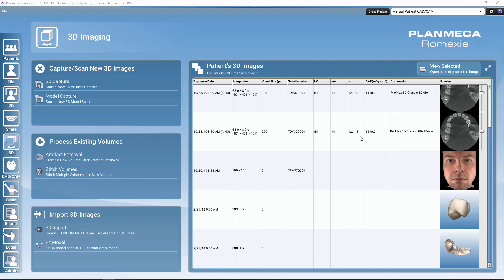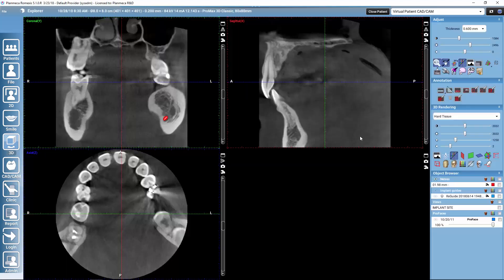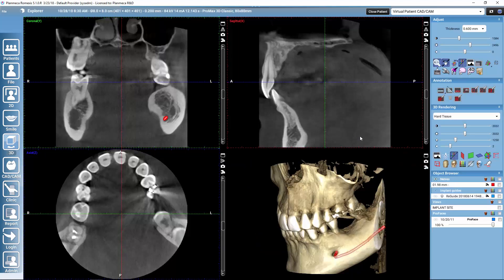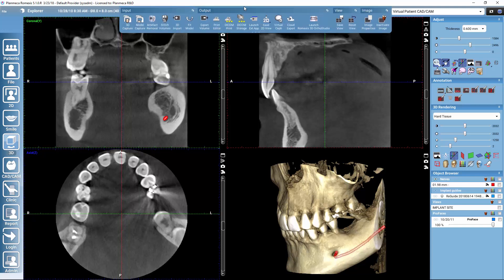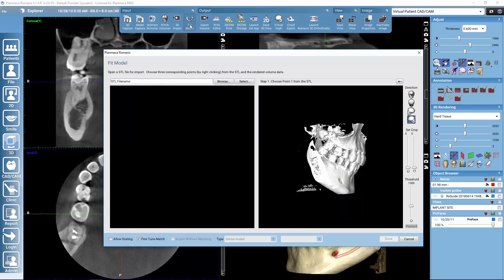So let's start by opening the CBCT, and it will be on top of this that we will then map using the fit model tool that we find here on the upper toolbar. So we will fit the intraoral scan on top of this volume.